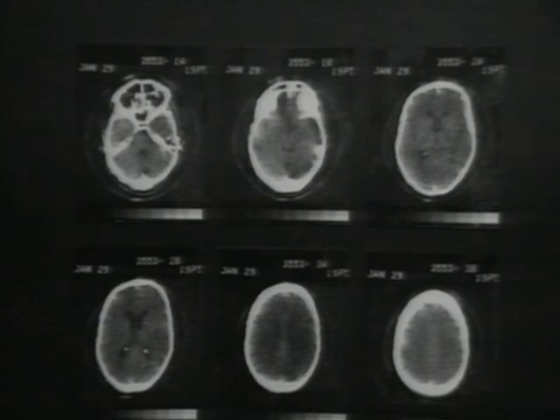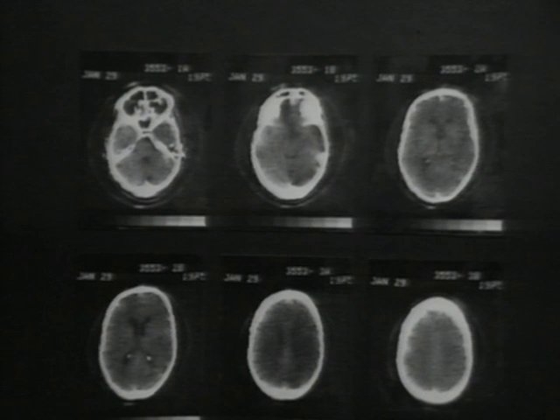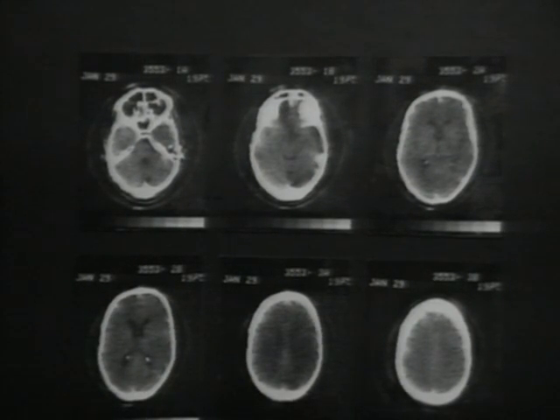In neurological practice, the common lesions which require identification are cerebral neoplasms of all varieties, hematomas, infarctions and infections. To this list must be added cerebral edema, which often accompanies these lesions and complicates the clinical picture as well as the findings presented by other methods of investigation.